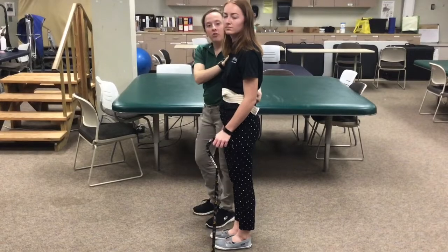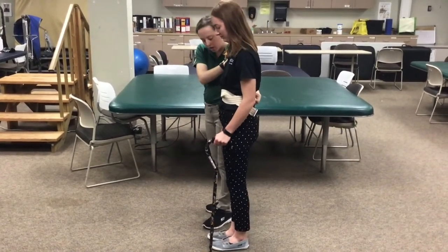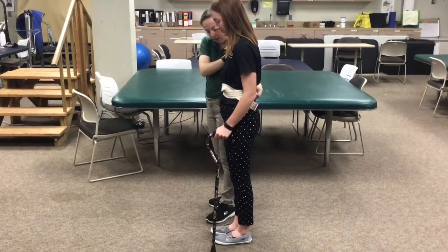With improved strength, your patient can move the cane and the injured extremity at the same time. So go ahead and move your cane and your involved leg at the same time.